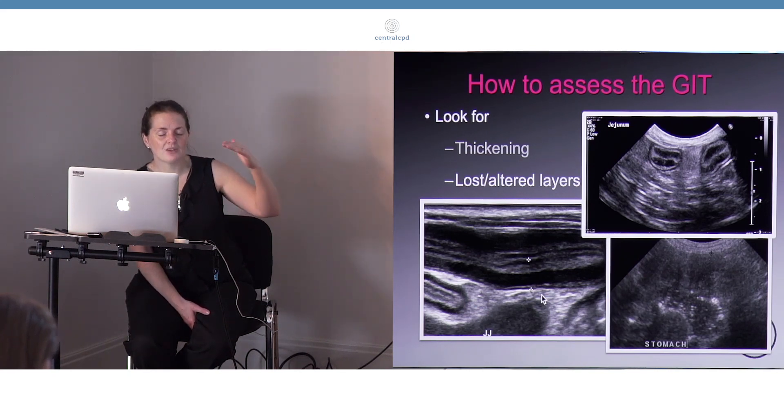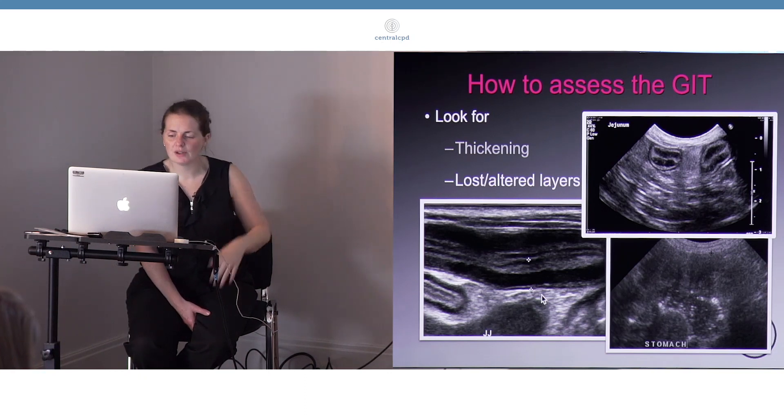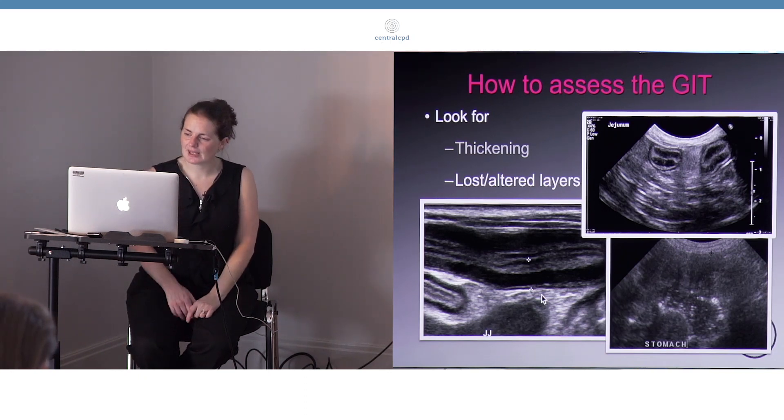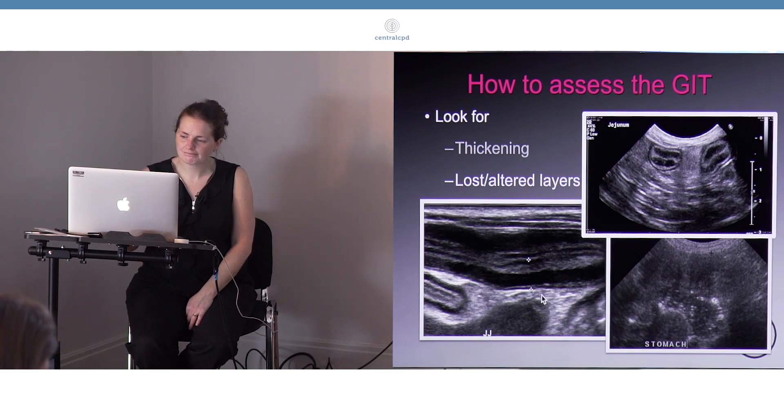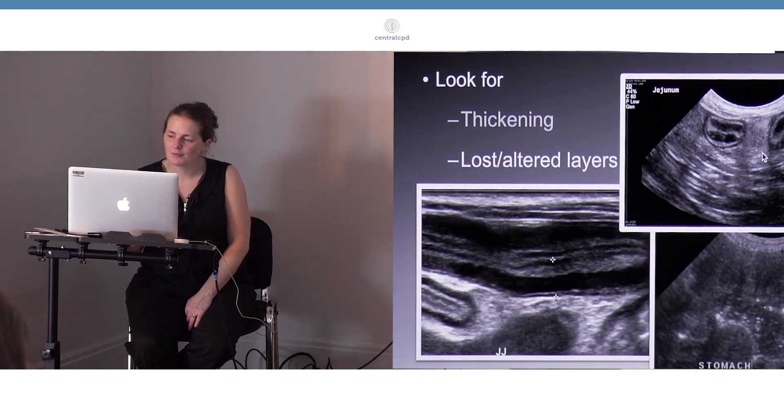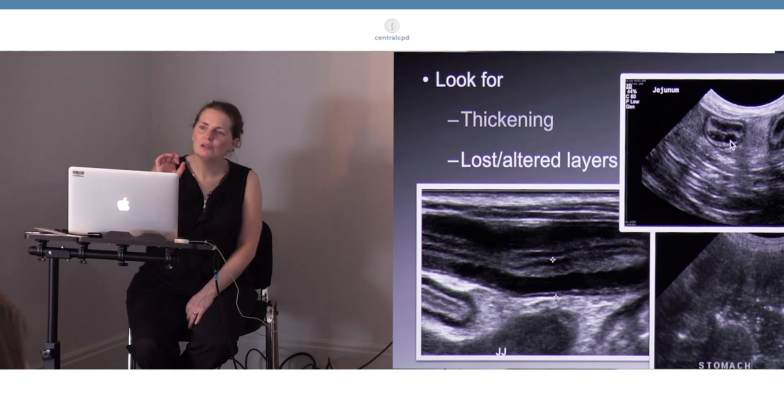So having an extra layer is not necessarily a worrying finding, but I think it's worth certainly looking at and making sure that you then assess the distribution of your layers, which certainly has been associated with clinical disease. And the final example I want to show in this sort of appearance is when we look at the mucosal layer.